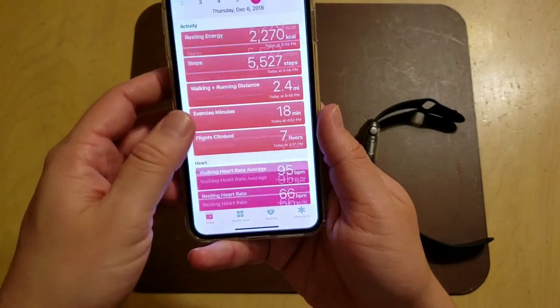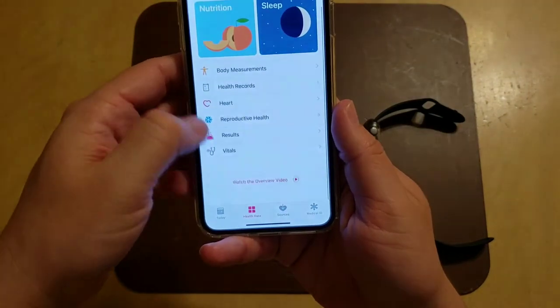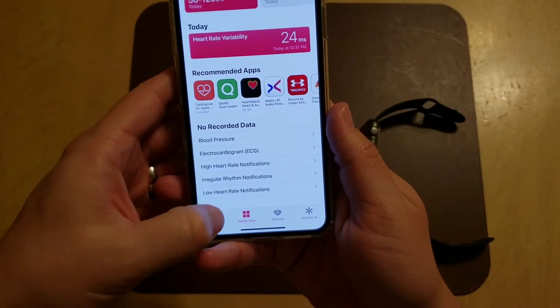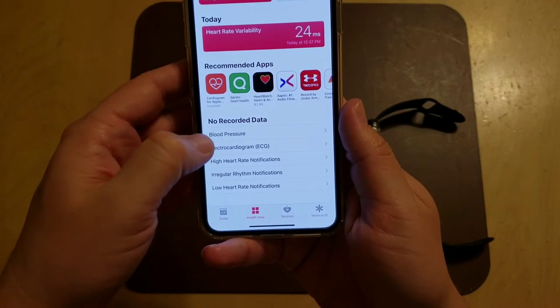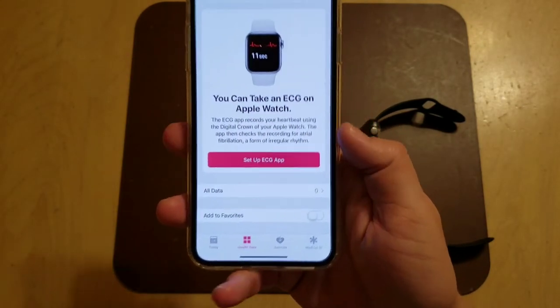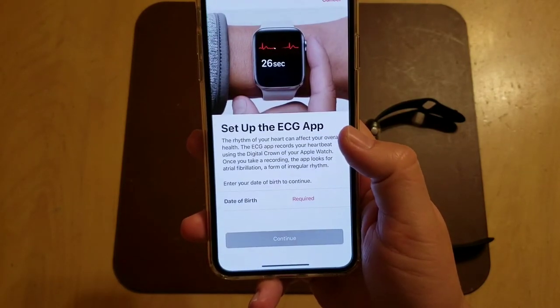Go into the Health app — it should automatically pop up the first time. But if not, go to Health Data, go to Heart, scroll down to the bottom, and click on Electrocardiogram. It'll say okay, time to set up — so you can take an ECG on your Apple Watch. Tap 'Set Up ECG App.'